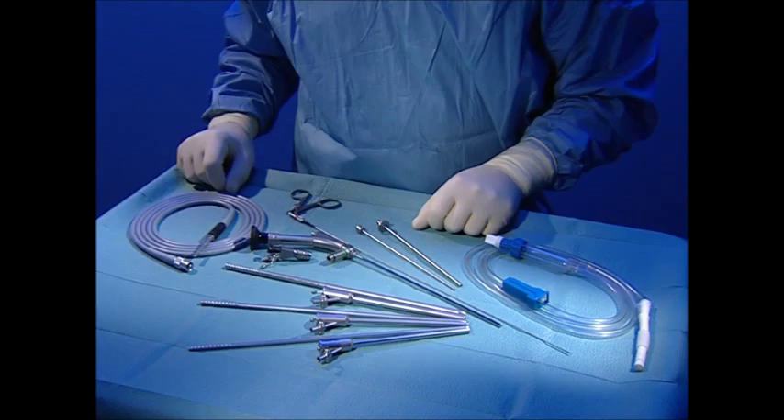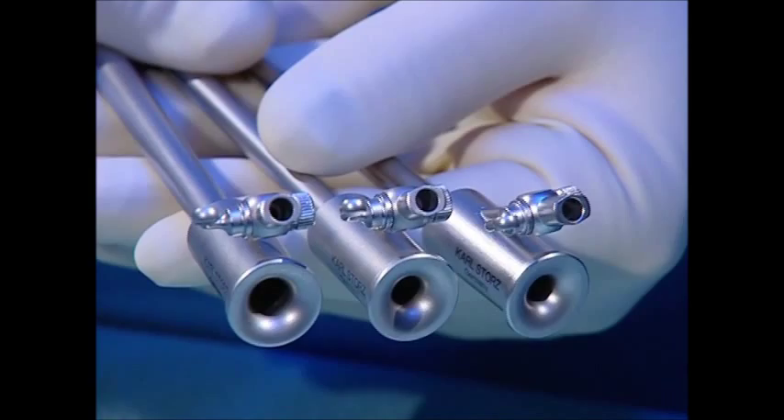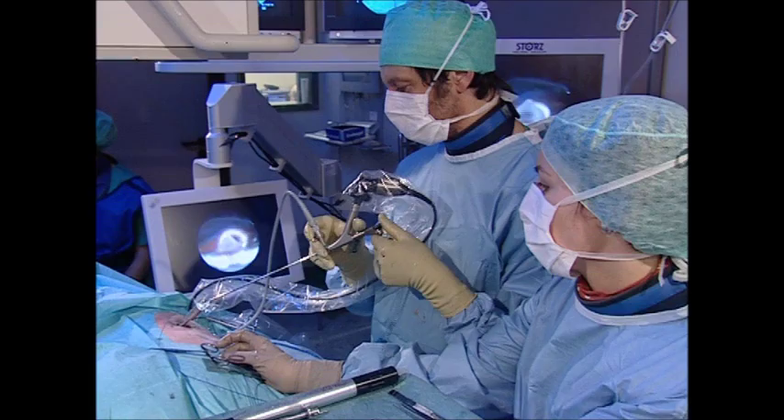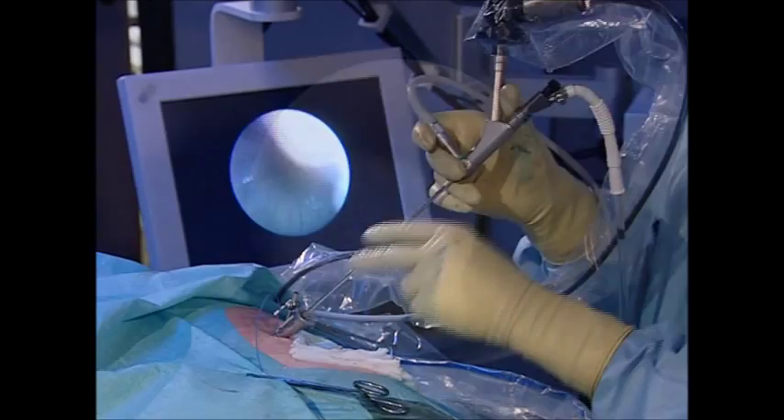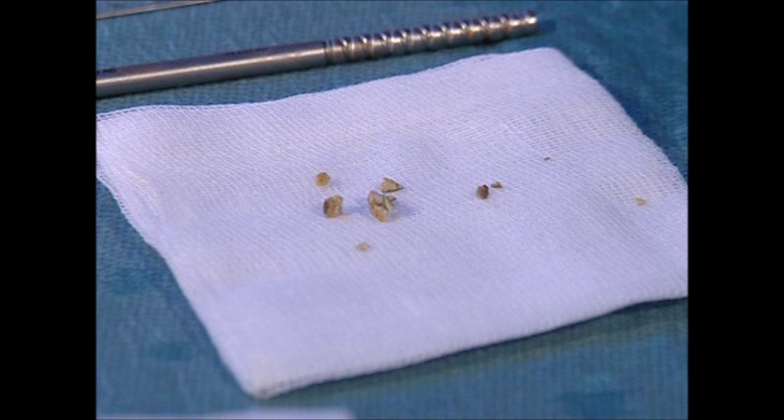All sheaths have a specially designed trumpet-shaped end which facilitates introduction of the nephroscope. In the two larger sheaths, the hydrodynamic properties create a vacuum cleaner effect which permits rapid removal of stones up to 4 mm in size by irrigation without additional deployment of instruments. This vacuum cleaner effect, achieved by the low pressure irrigation flow, enhances patient safety.